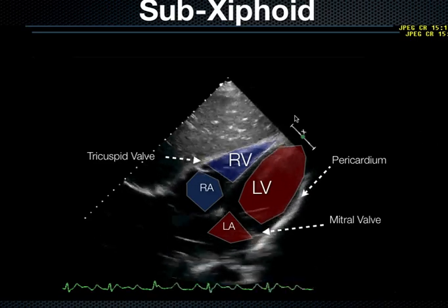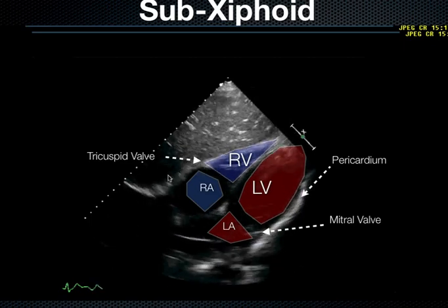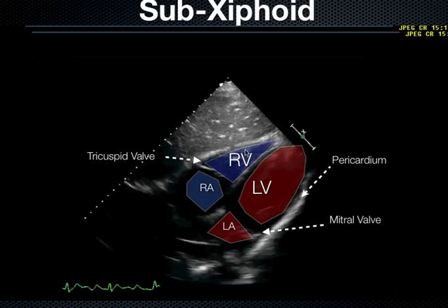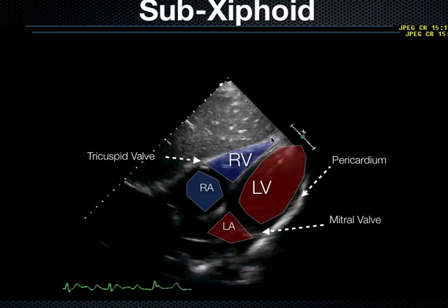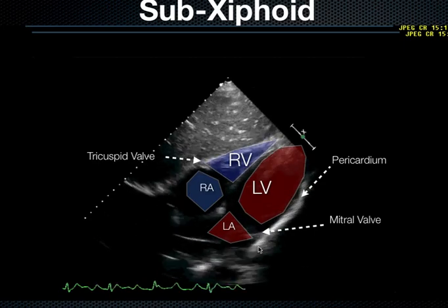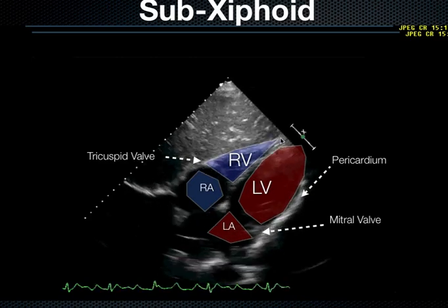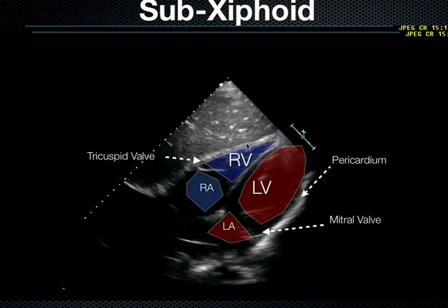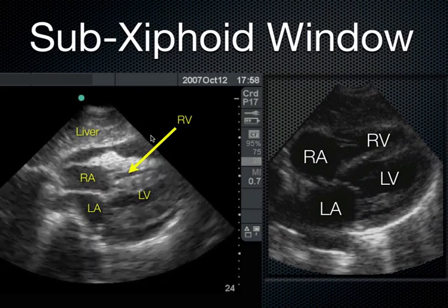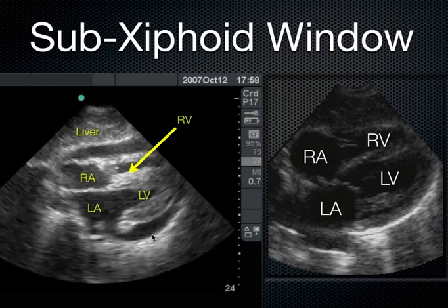The second thing I use this for is pericardial effusions. This is the best view, the most sensitive view, to check for somebody having a pericardial effusion, or fluid between the myocardium and the pericardium. You see, in a supine patient or somebody lying flat, the heart is heavy, and it sits in its posterior pericardium, squishing any fluid anteriorly. And so this is exactly where you see these pericardial effusions, right along this anterior area, like we do here.